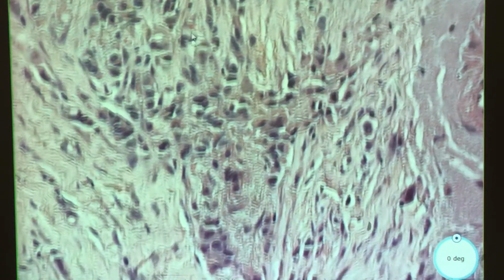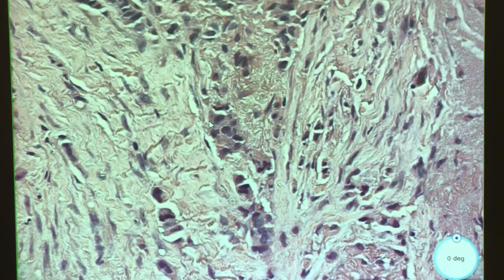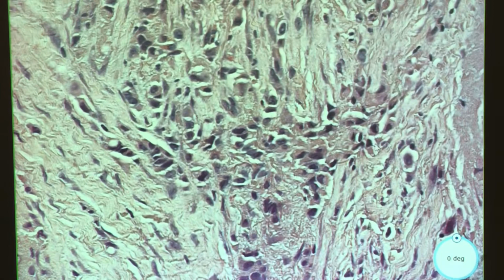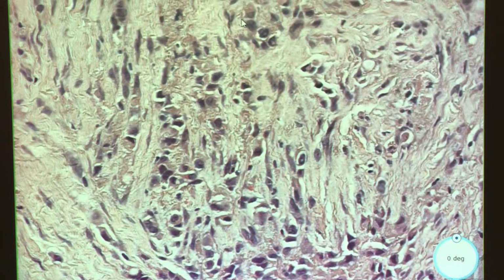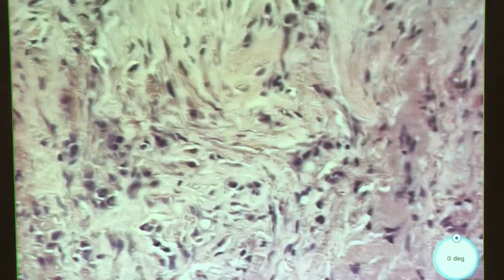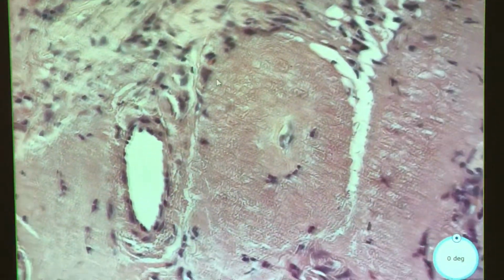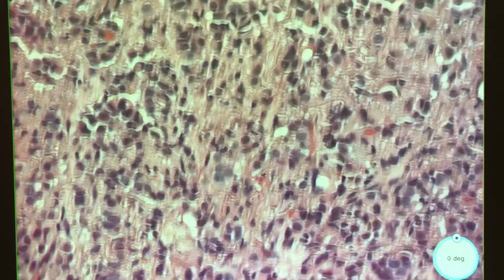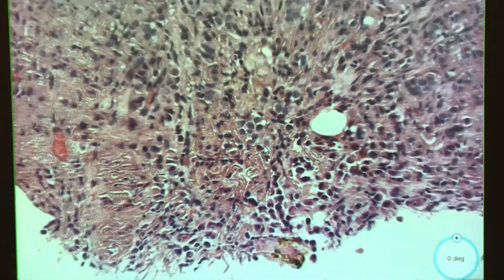If we look at the cells, and this one we can scan in a little higher, we start seeing, whoa, there's some weird looking cells. So I can't call this a 1 for nuclear pleomorphism. We're still at the 3 for tubule formation. And again, there's not going to be a whole heck of a lot of mitotic figures from what I remember, but everyone, again, please spend some time on these.